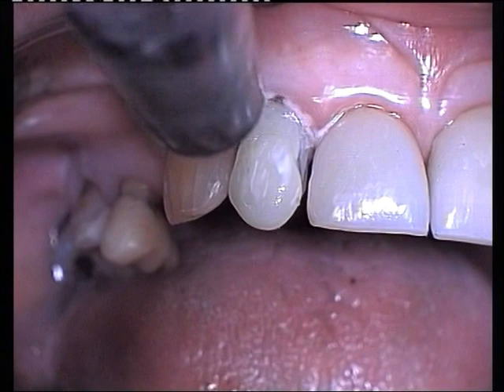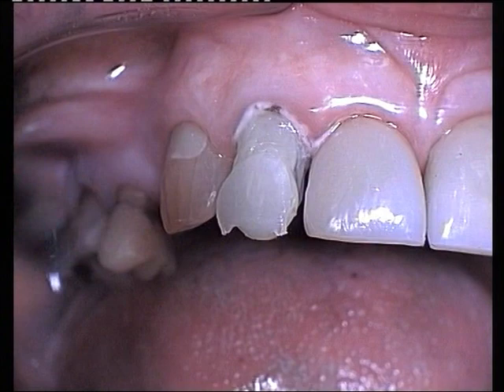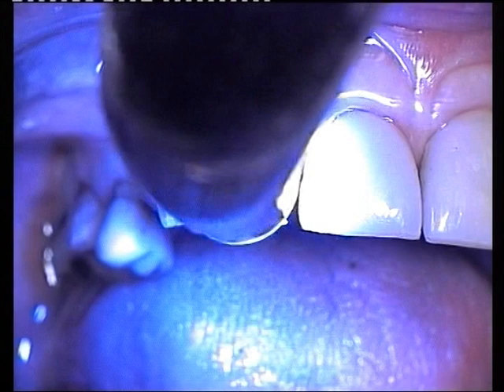After spot-curing, a small increment of incisal shade micro-fill resin is puddled over the incisal third of the crown. It is spot-cured for about 5 seconds.